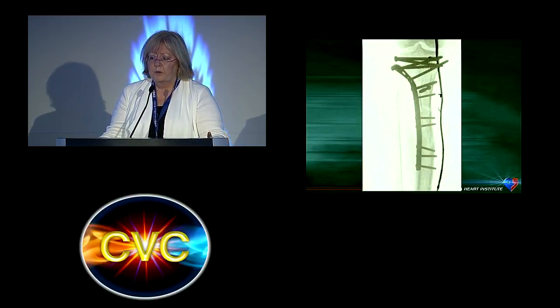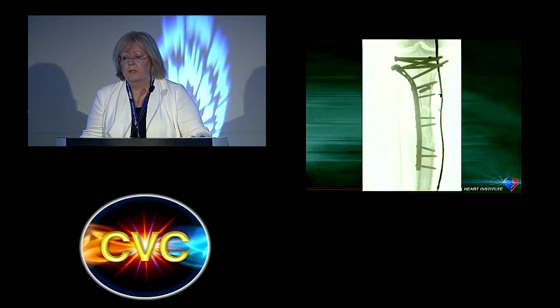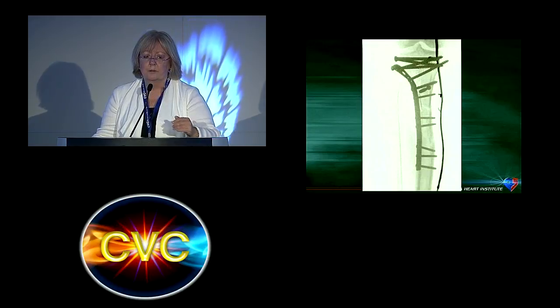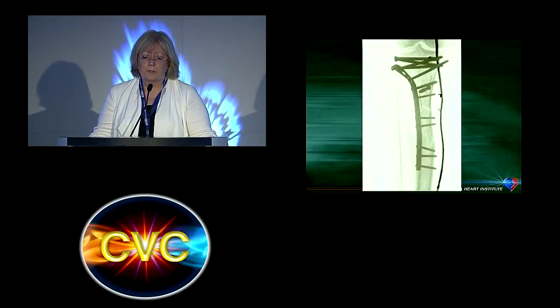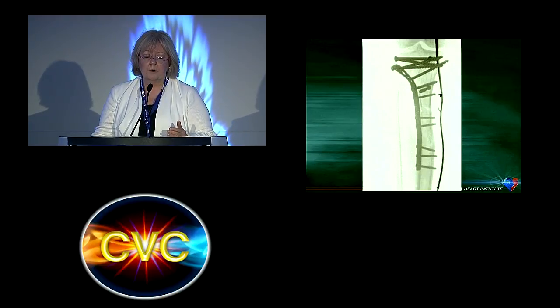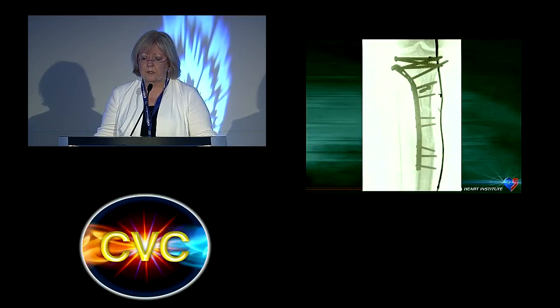So here is a venogram of a person who has DVT. I really like this set of slides because you can tell it's the same person because of this hardware. But after an orthopedic procedure, after a fracture, the patient developed DVT in the upper calf. Now, without a tourniquet on, you just inject a pedal vein to do a regular old venogram, and all you see is a saphenous vein.